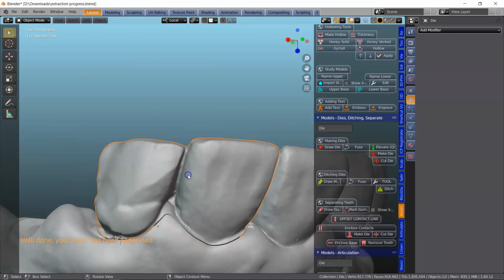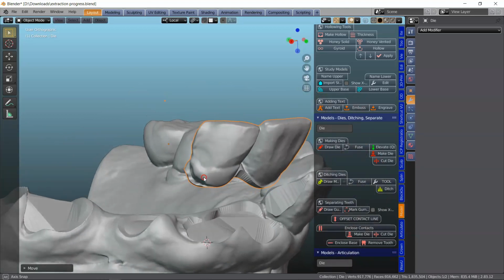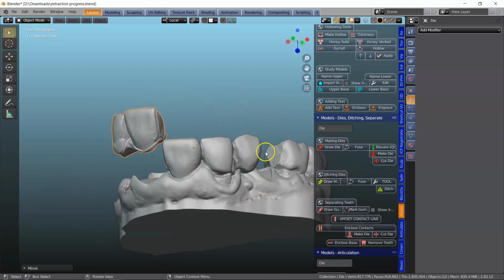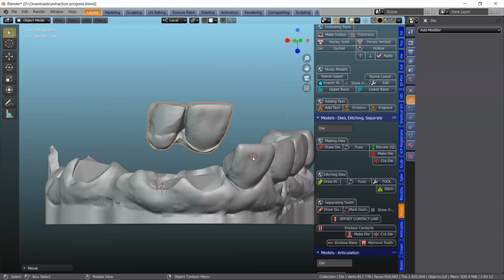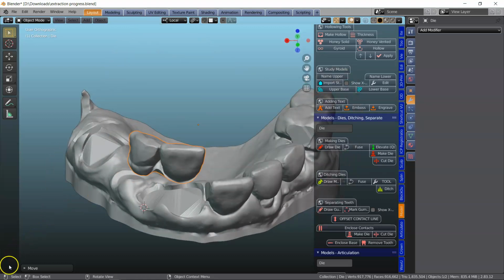As you can see, this is removed quite well. It took a little bit of time because of the density of the mesh. So you just remove that one, and it takes a bit of practice. Try and make sure that it cuts, and if it doesn't cut, rather go Control Z backwards and redo it. Otherwise, we're going to end up with a completely contaminated mesh. Okay, cheers.